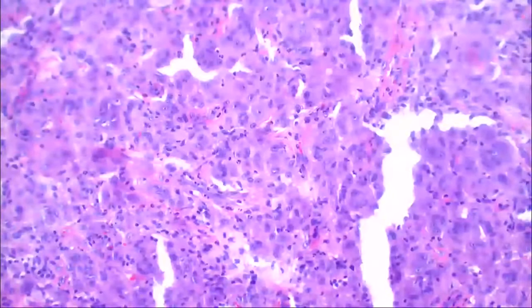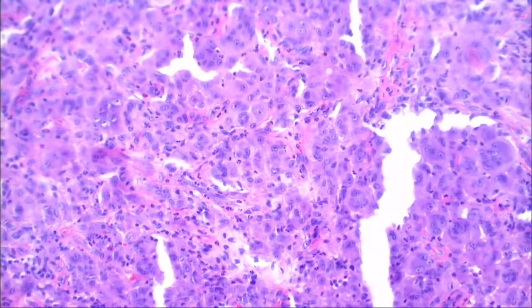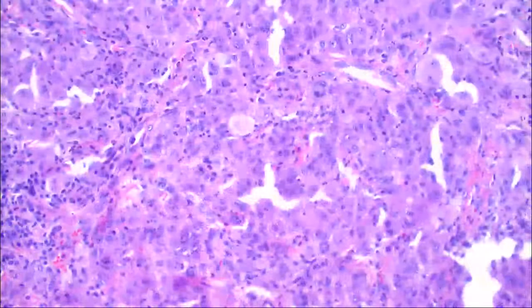And this might be a juvenile xanthogranuloma or an adult xanthogranuloma that's just got a lot of reticulohistiocyte-like cells in it. I looked for Touton cells and I didn't think there were very many in here. You're right, and sometimes you just don't see very many.